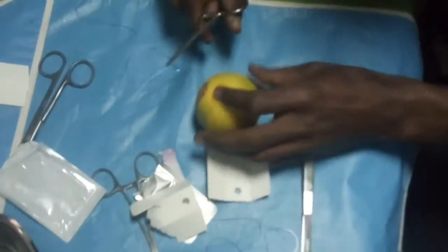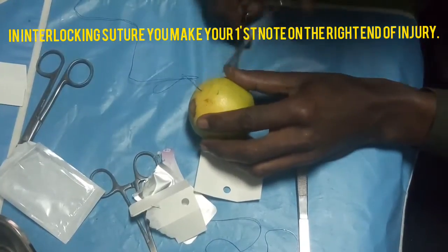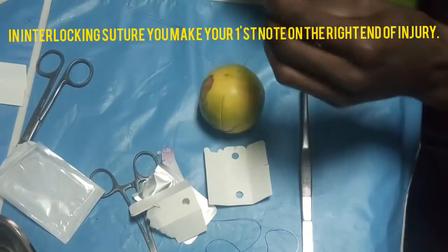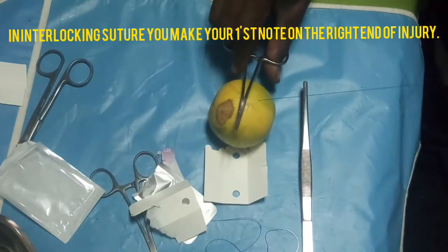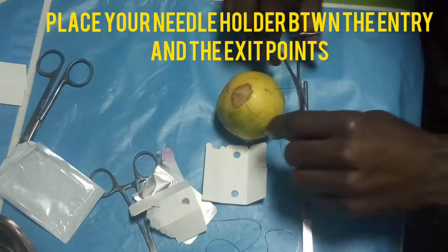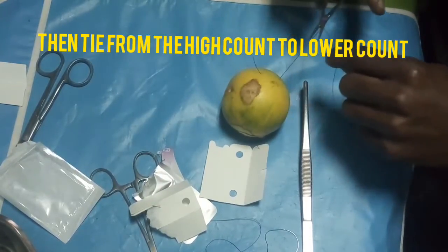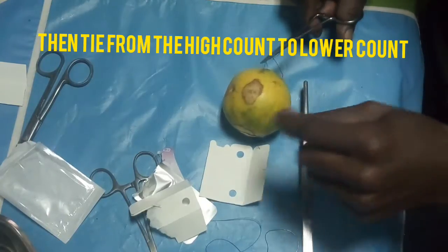So we are going to start with the first incision. You put the needle between the entry point and exit point, and then you count 1, 2, 3, a few centimeters, then you clamp.